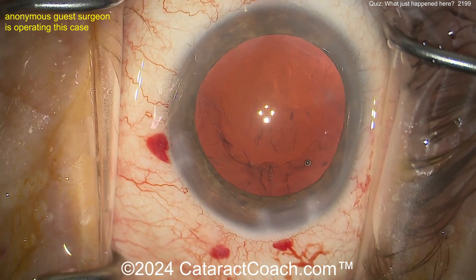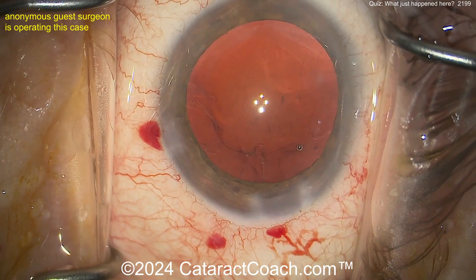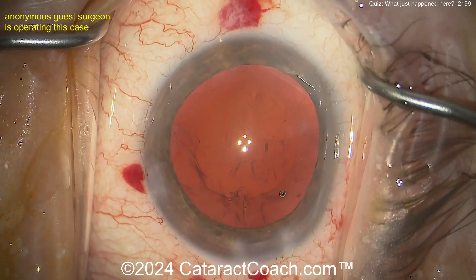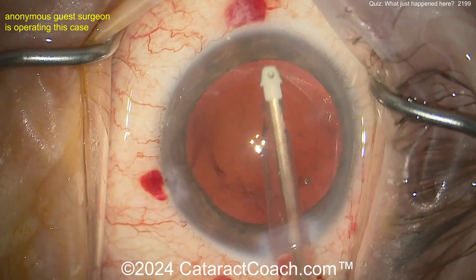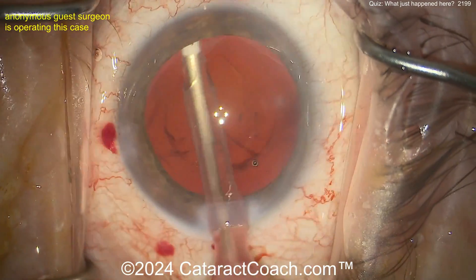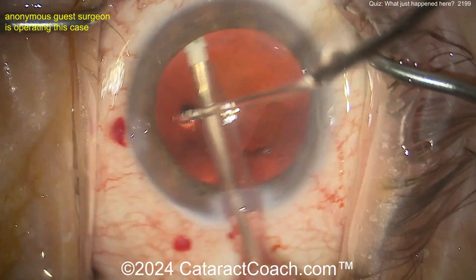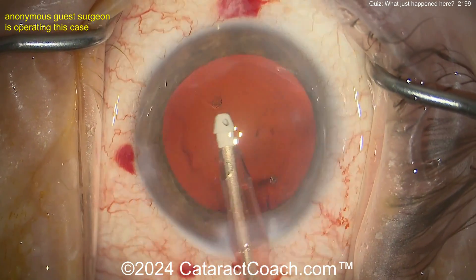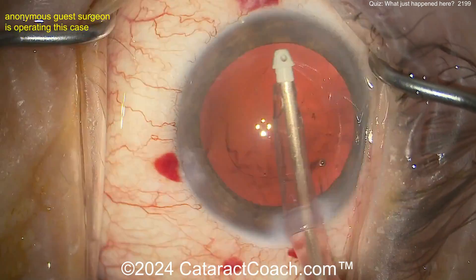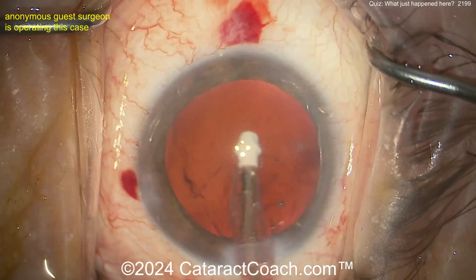All right, let's take a look — coming in with the IA probe. If you're a senior resident in the USA, it's May, you're graduating next month, or you're a fellow finishing a fellowship next month, you better know the answer to this question. Watch carefully: cleaning up the cortex, want a nice clean capsule bag. Grab some stuff here, looks pretty good. Now watch carefully — cleaning up cortex again, and now what is this? Did you see it? You better go back if you didn't.